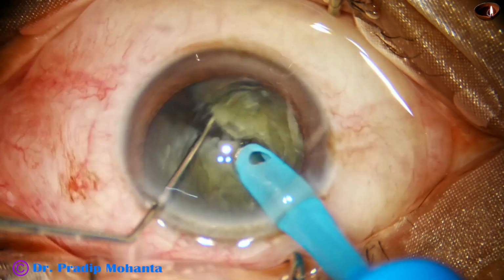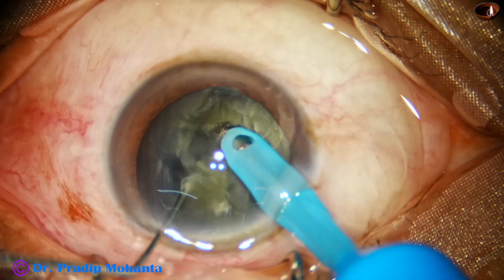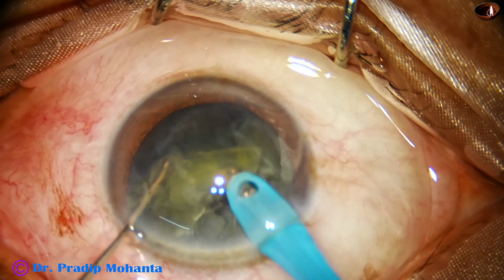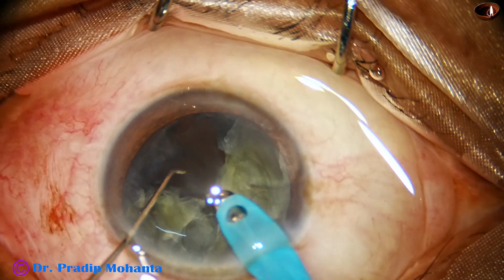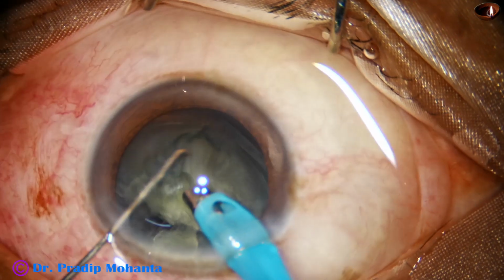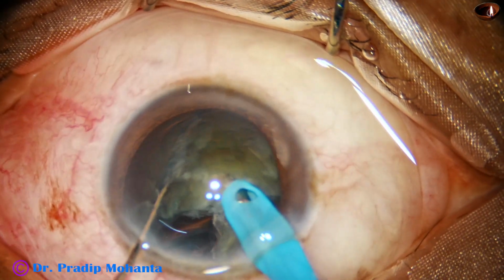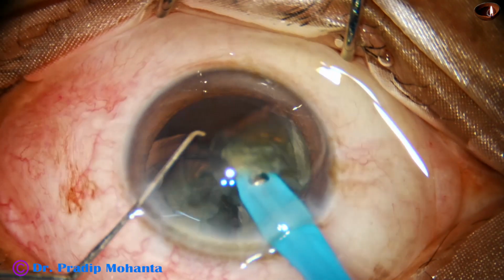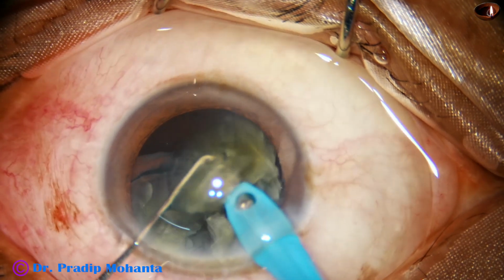and chop. Again held and chopped. Now this piece is emulsified and the tip is at the center. It doesn't look like the rent has occurred yet. This semi-nucleus is chopped into 2 fragments, and one fragment is emulsified.